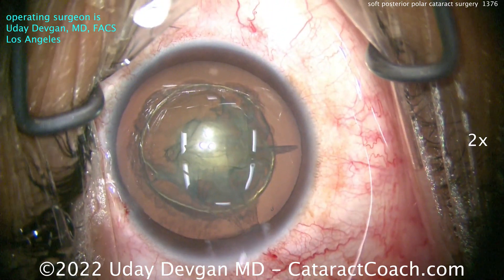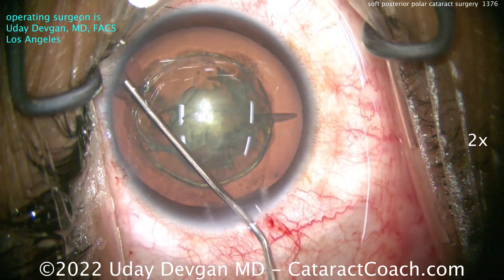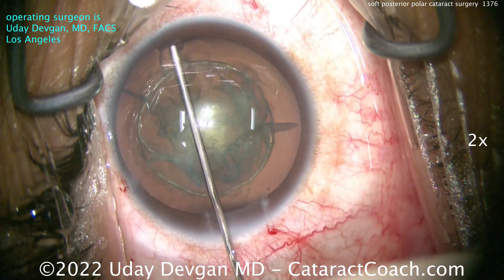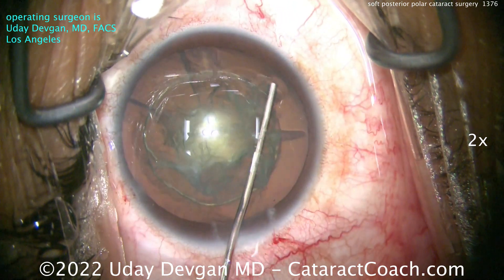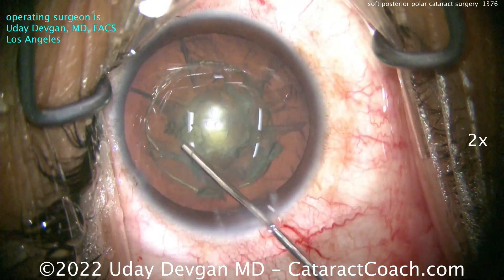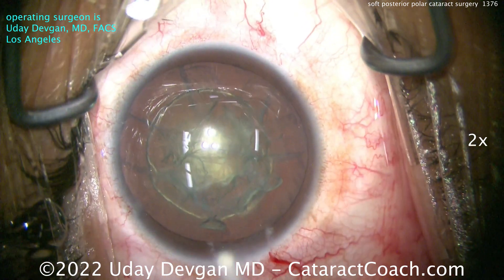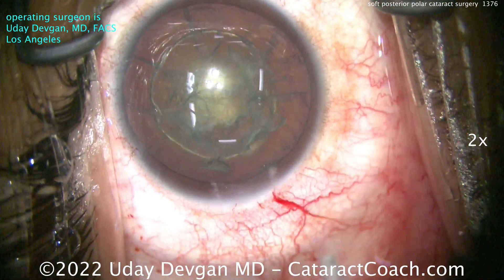You can see how soft and mushy the lens is. So actually, let's go straight to visco dissection — visco dissecting in all quadrants. This lens is soft; the endonucleus is already out. We'll visco dissect in all four quadrants using a dispersive viscoelastic. You can inject it there, and now let's take the IA probe.